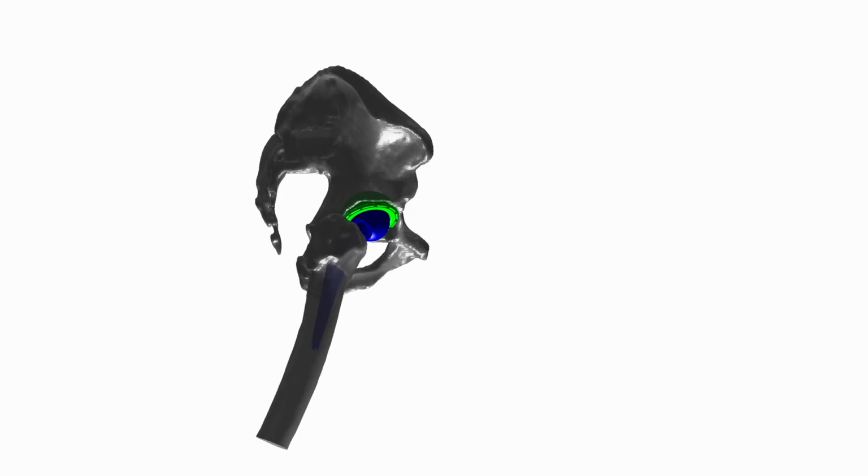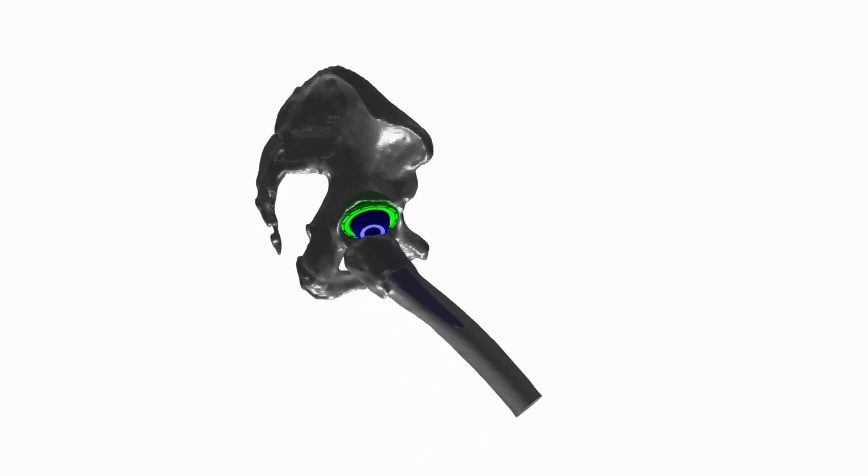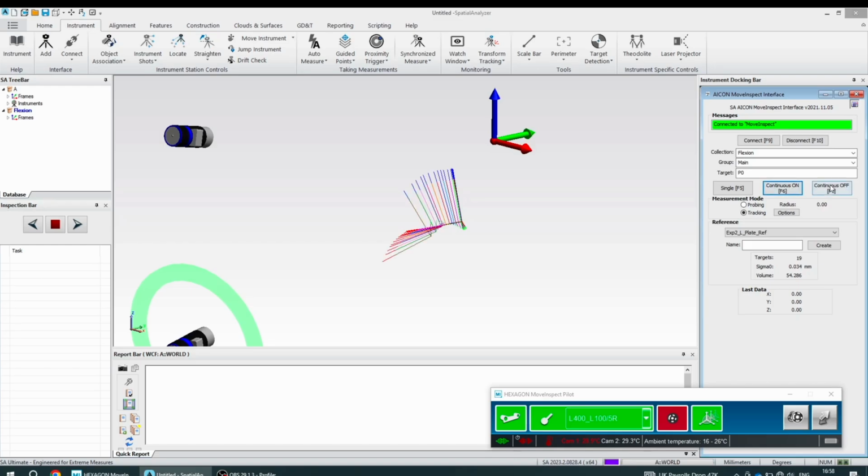But now, this team at University Hospital Coventry is working on taking hip replacements even further, making them even more personalised to the patient with the use of computer simulations to effectively wind back time. Everybody's hip moves differently. And so what we're trying to do is reverse engineer the patient's hip back to how it was before they ever got arthritis. And then in a computer simulation, see how it moves and make sure our hip replacement will do the same.